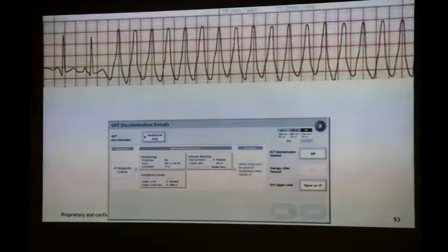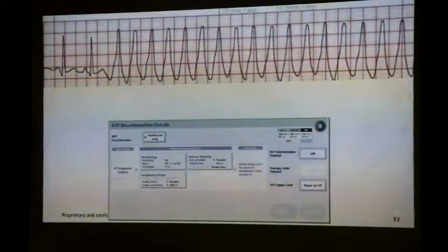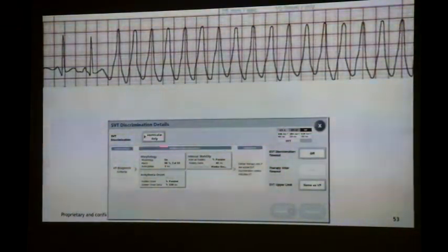Because you can imagine if you had a patient at 60 beats a minute, and then they go into VT at 179 beats per minute. Their zone is programmed at 180, and they're at 179, 179, 179, and then they just go across into the VT zone. What's sudden onset going to say? Nothing. It's going to say hold off therapy, because it would measure between 180 and 179. And sometimes you see that. So interval stability and sudden onset are not particularly helpful. So we recommend morphology on.